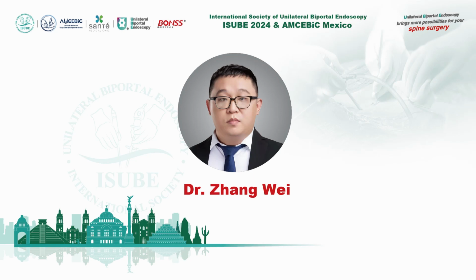Second, we cannot choose the interlaminar approach because the disc space is not at the same level. So we can choose the keyhole. The translaminar approach is a common approach.